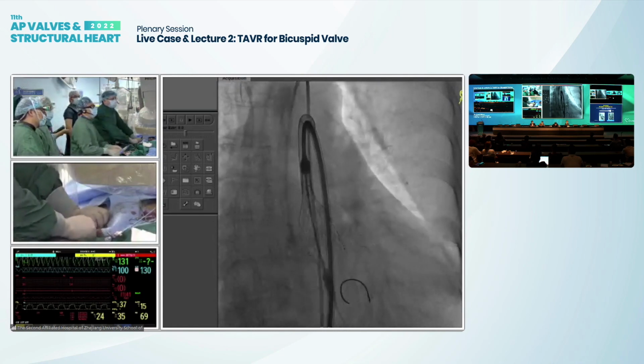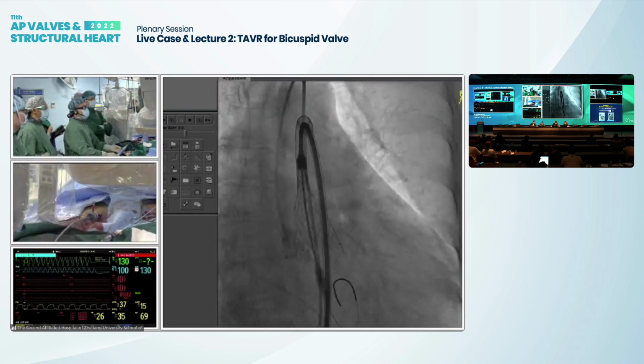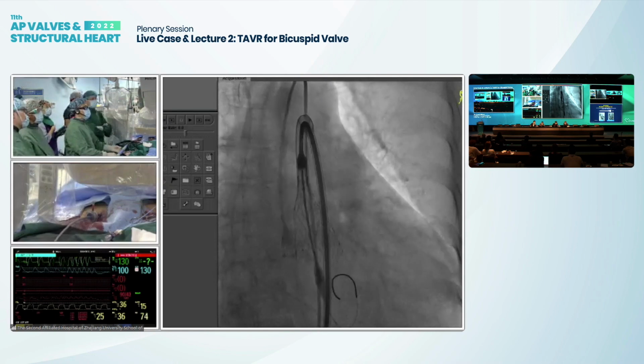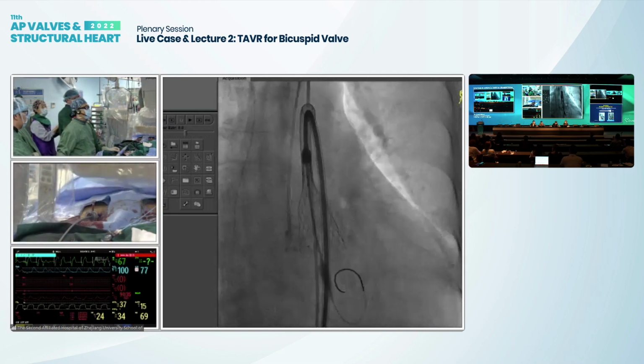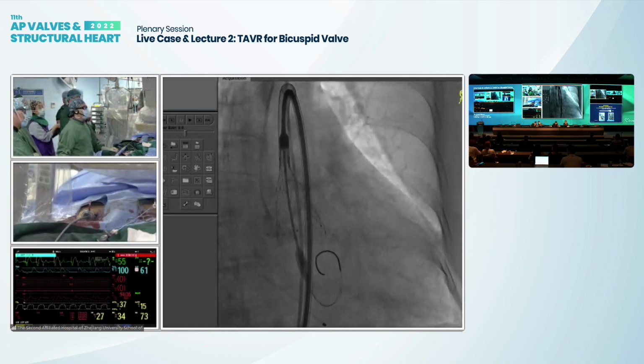I don't think the position has much change. It's quite similar to the last one. You have to totally release it. If you want to push it, you have to push it down to push it across. Otherwise, it's too short.